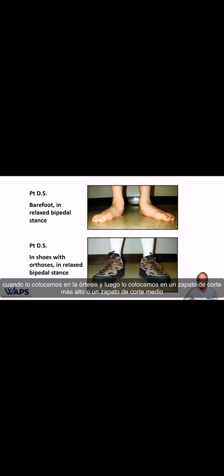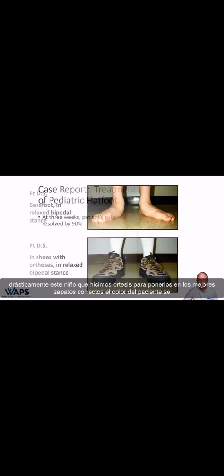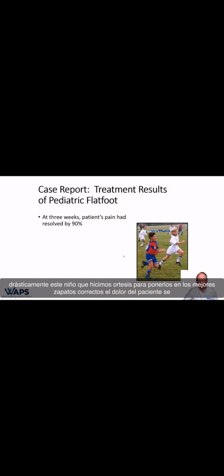When we put him in the orthosis and then into a higher cut or mid-cut shoe that helps support the ankle, there is a large difference in the foot shape, the ankle shape, and the morphology of the foot, not only during standing, but also the gait had changed dramatically. In this child that we made orthotics for and put into correct, better shoes, the patient's pain had resolved by 90% at 3 weeks' time.